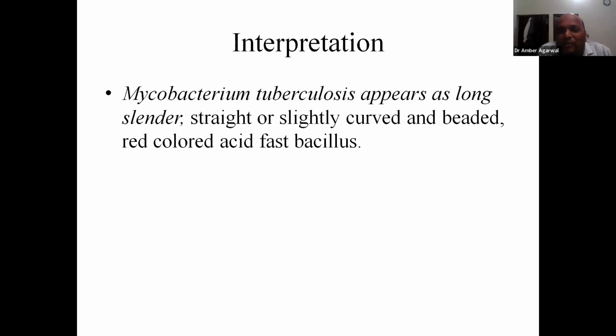But what is happening is, finally, they have sent for histopathology, for AFB examination and for GeneXpert. Luckily, the AFB was seen nicely, and GeneXpert came out to be negative. Then they sent it for TB culture. And in TB culture, there are different species; for example, if you have a surgical site, it would be abscessus most commonly, and some of them are rapid growers. Right now I don't remember which are the rapid growers and slow growers. So it grew there, and then the diagnosis came out.